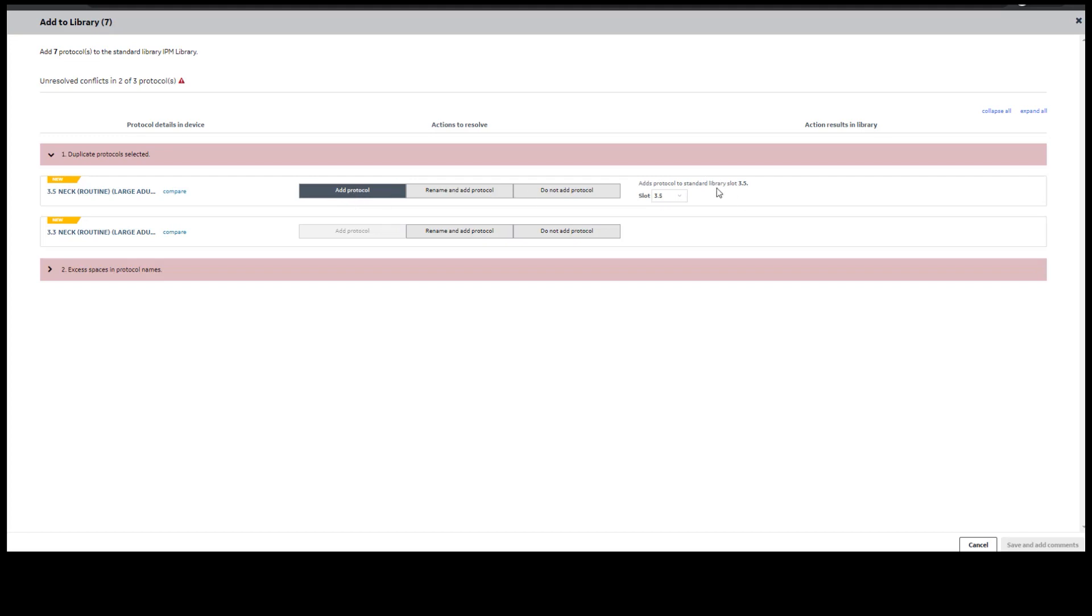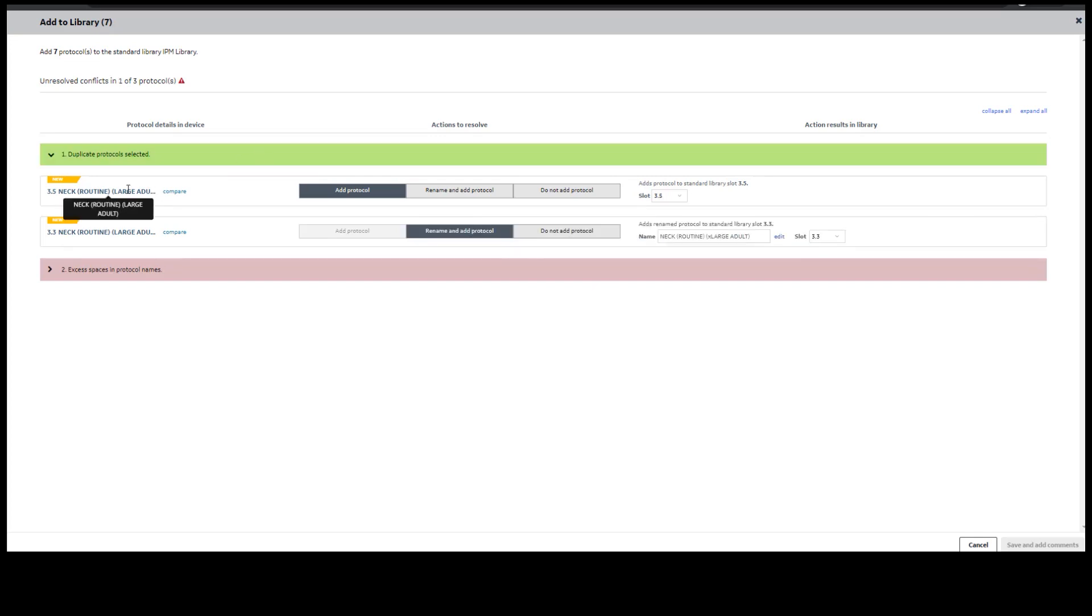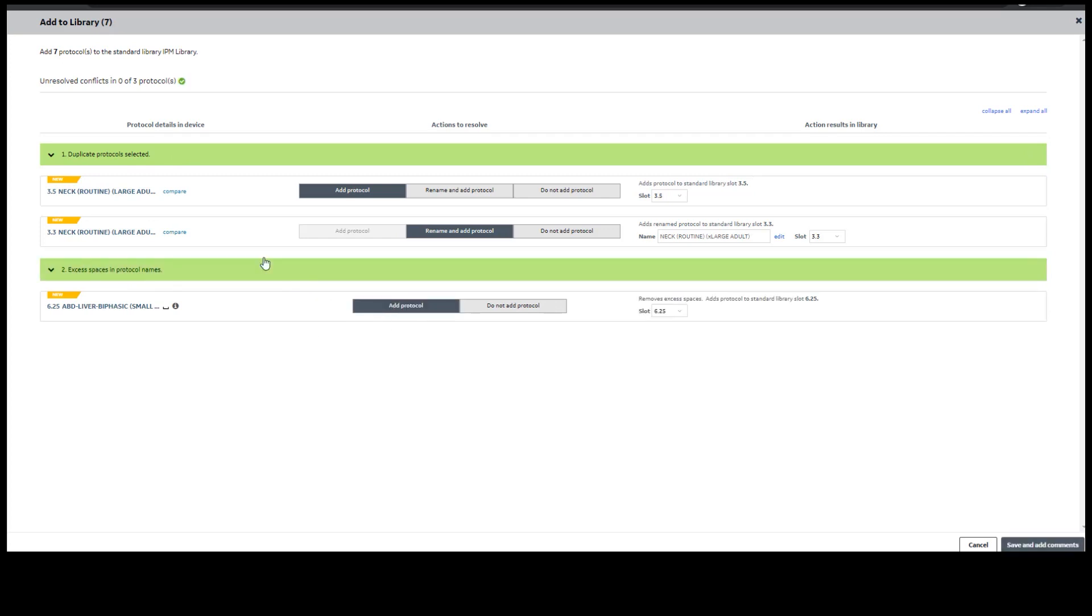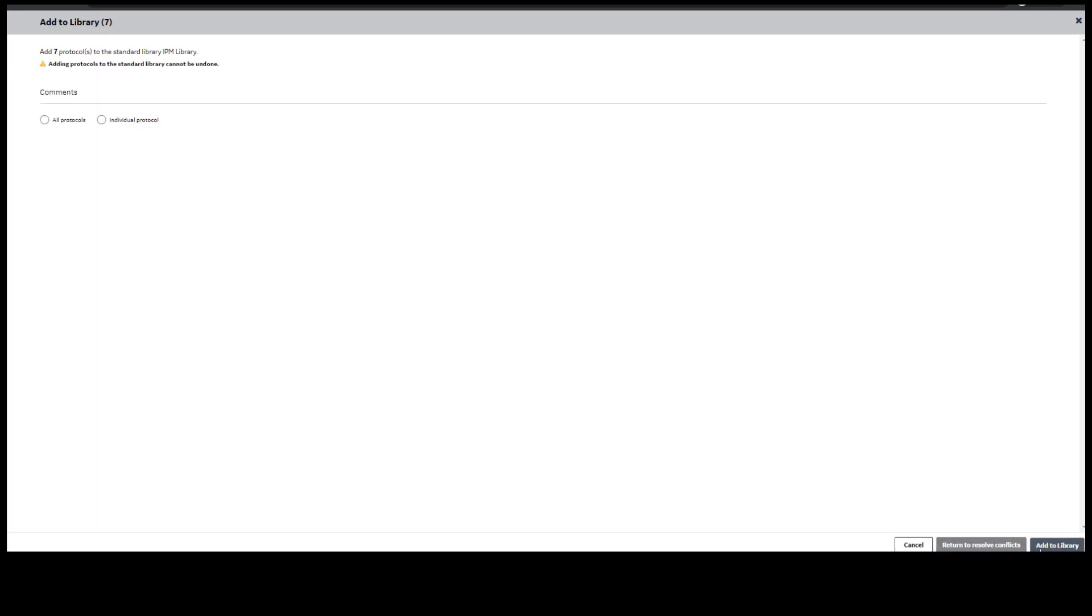If we want to add the second protocol to the standard library, we would have to change the name. Once the conflict is resolved, the bars will turn green and you will be allowed to continue and add comments at an all protocol level or an individual protocol level for an audit trail.